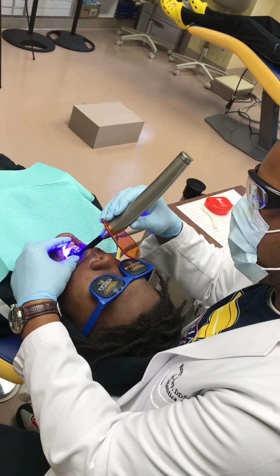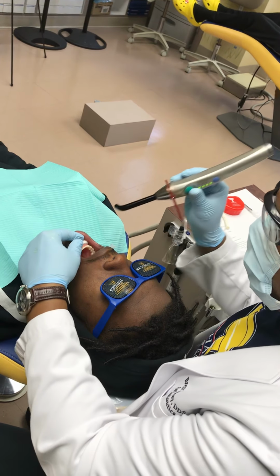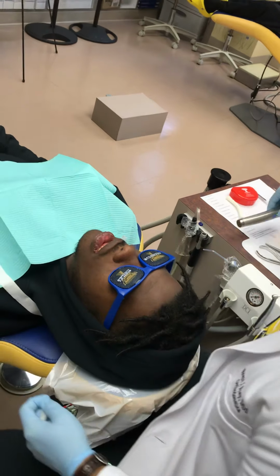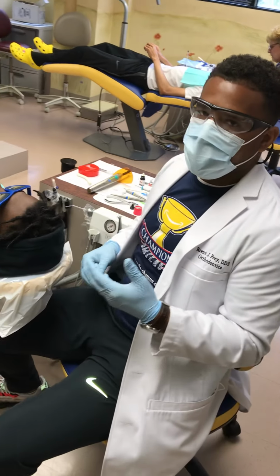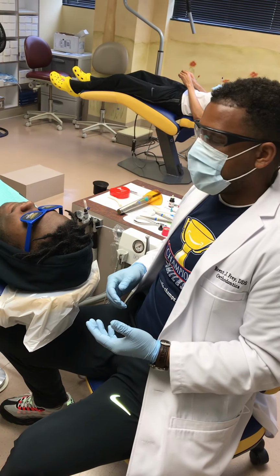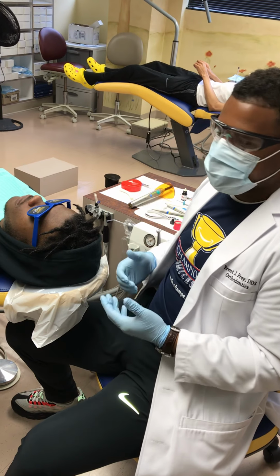Okay, so I'll just cure everything one more time, make sure that it's set, and we should be good to go. So from here, you can instruct your patient on how to floss that retainer, how to take care of it, let them get used to the way that it feels, and you're good to go.